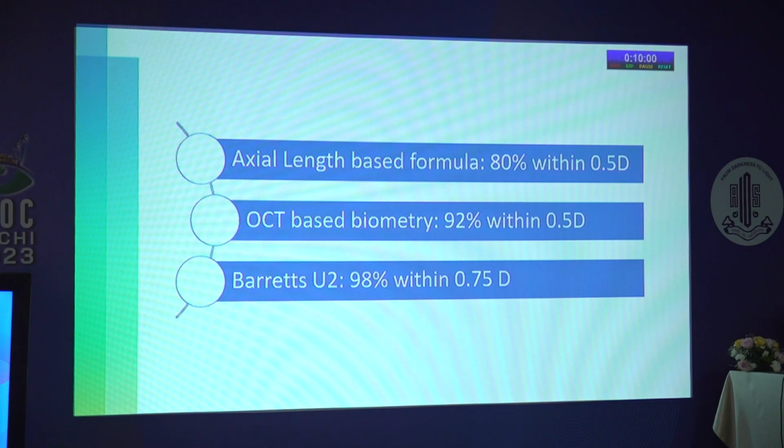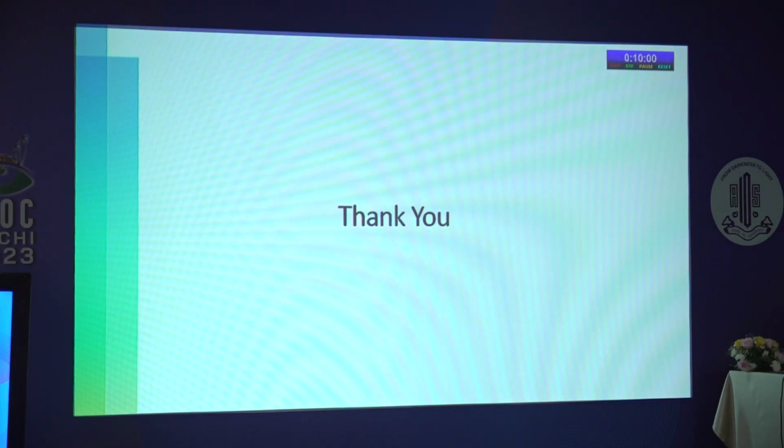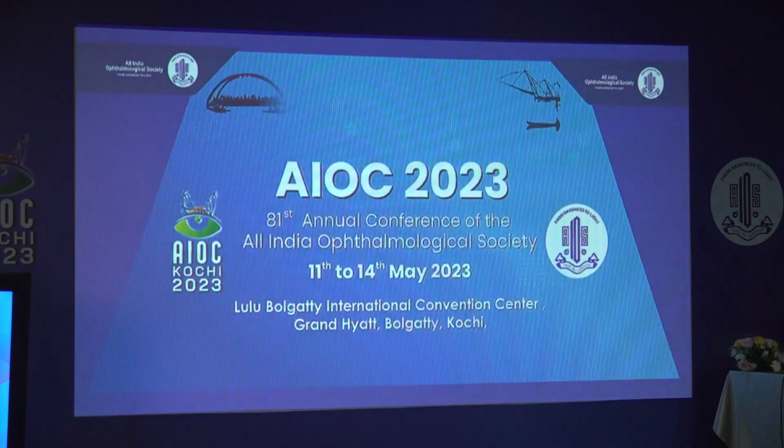We undercorrect for about 6 diopters and we see the next day postoperatively it's just about 2 or 3 diopters. It's not always as predicted. Actually, I think it takes still longer for us to come to a predicted error of 0. I don't know whether it is possible at all. What is your experience? I would like to know from the panel, Dr. Satish. Do you exactly get what you predicted? I mean, in a 1-year-old, you predicted 20% undercorrection. Do you get them? Yeah, no, not always.